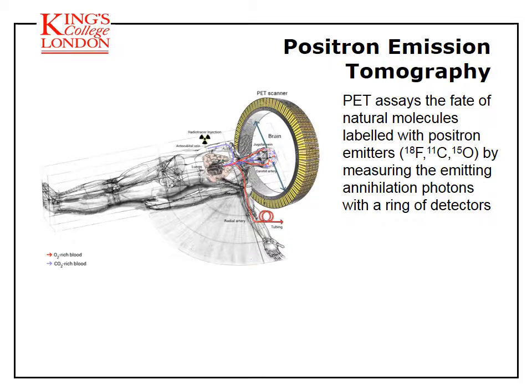This is the case for, say, oxygen-15 and carbon-11, or these emitters are really small, like fluorine-18, and they do not change the substrate's properties. PET instrumentation is built to allow the accurate quantification of radioactivity concentration in the image, but also in the circulating blood. Hence, PET technology is absolutely designed to accurately fit the three tracer principles.